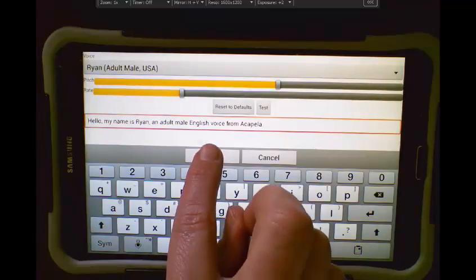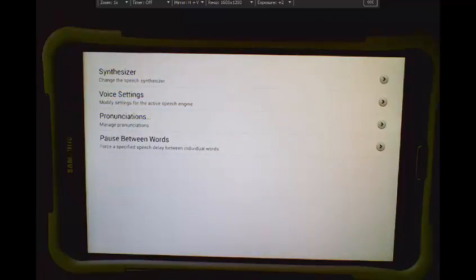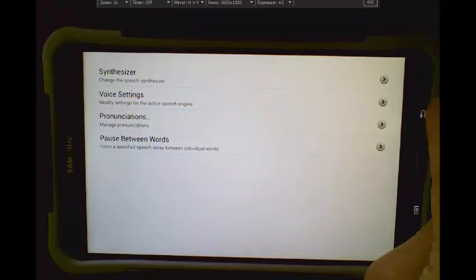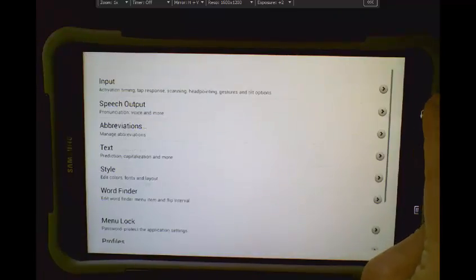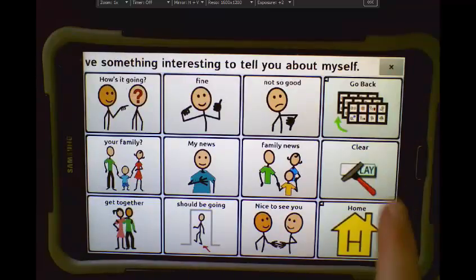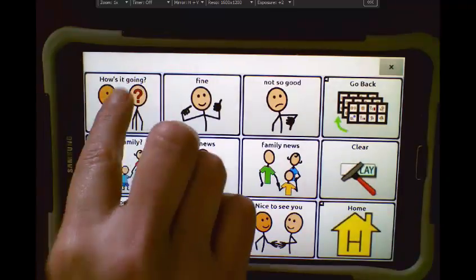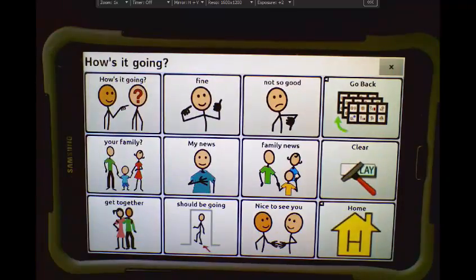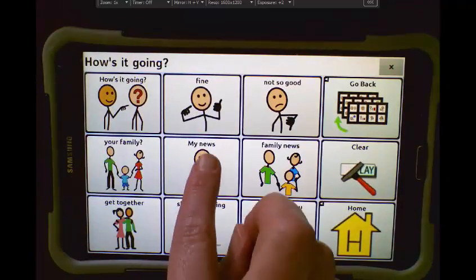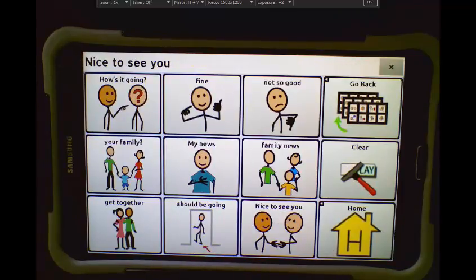Go ahead and hit Save, go back, and we'll test it out again. How's it going? I have something interesting to tell you about myself. Nice to see you.